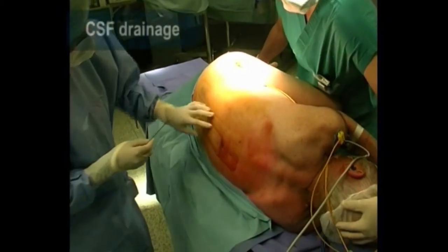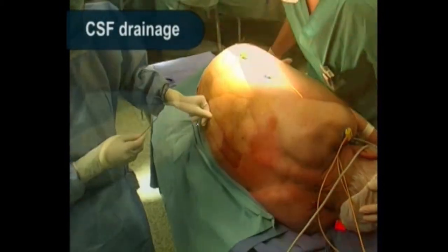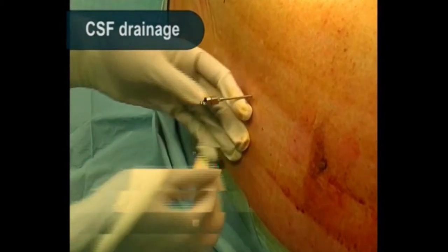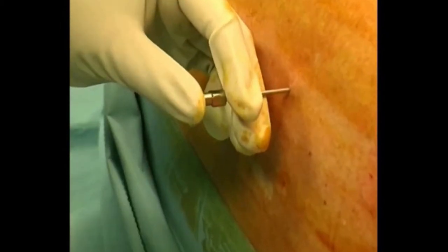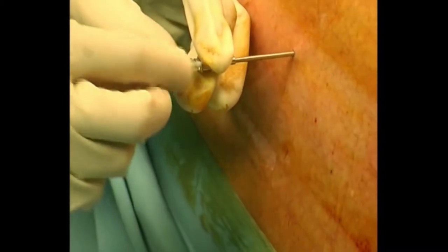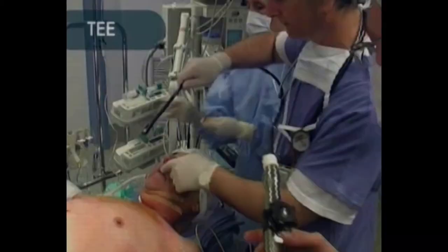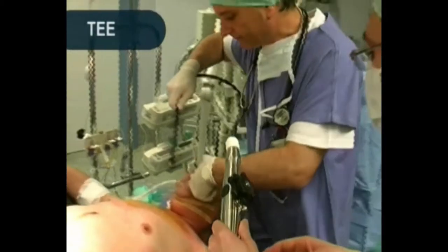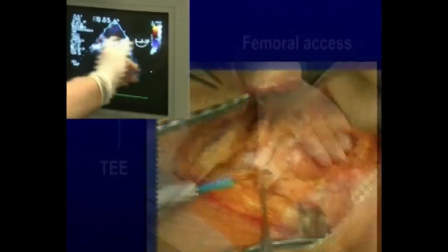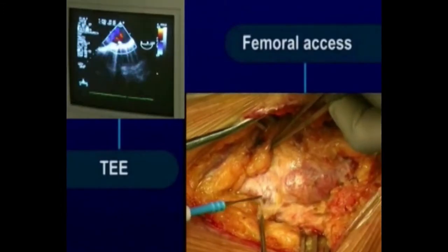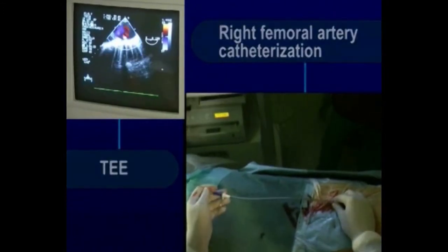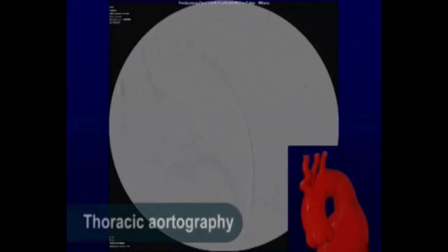The spinal cord drainage was inserted preoperatively and the patient intubated. The intraoperative use of TEE proves a useful adjunct to monitor cardiac status during the procedure and confirm adequate exclusion of the aneurysm in the thoracic tract.